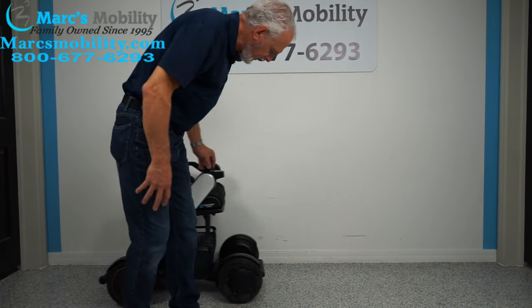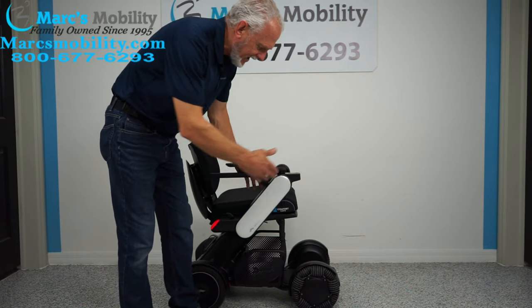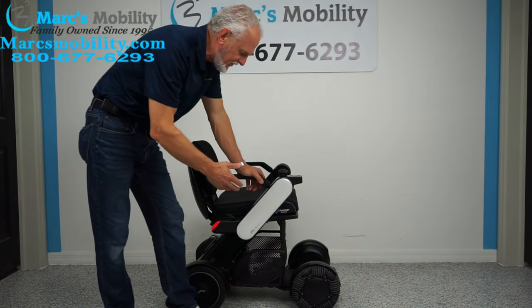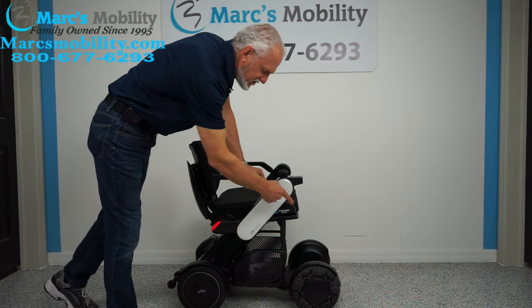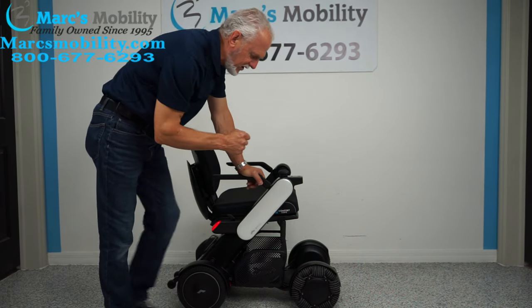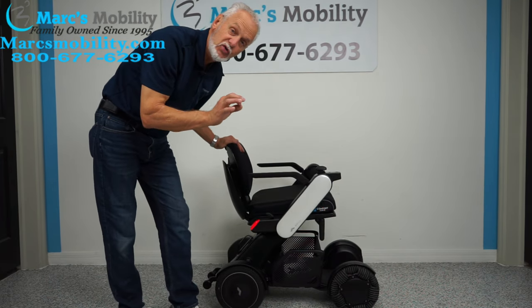You can see the roller — it rolls on the rollers on the front. And you can't tell when you drive the chair, there's no bumps, nothing. These are solid tires — 10 inch in the front, 10 inch in the back. This power chair's total weight is about 120 pounds.